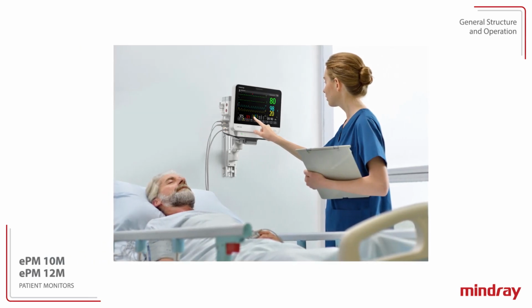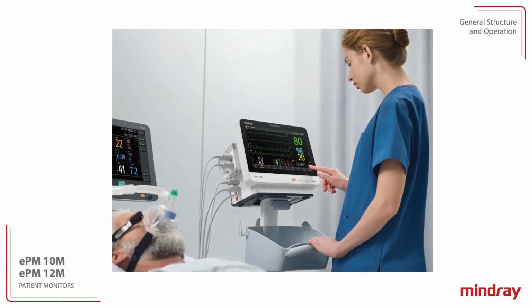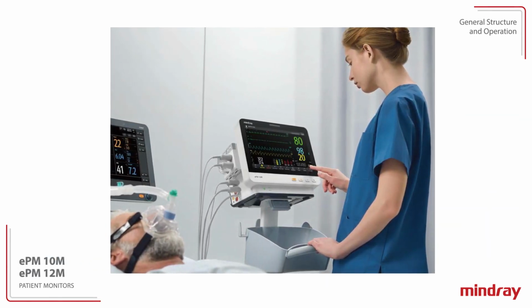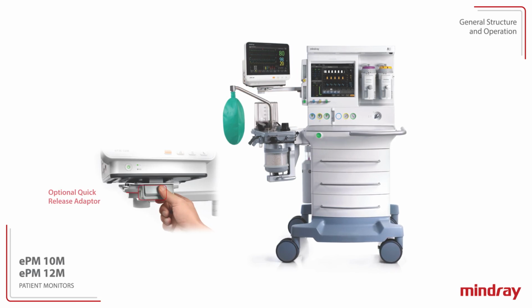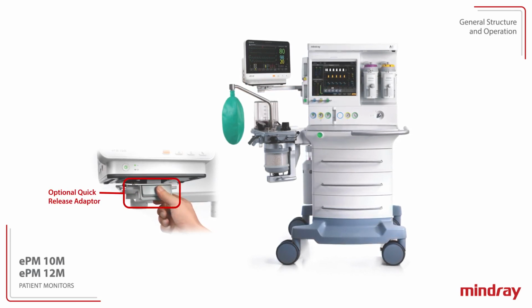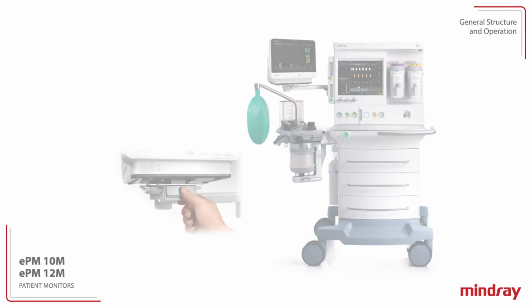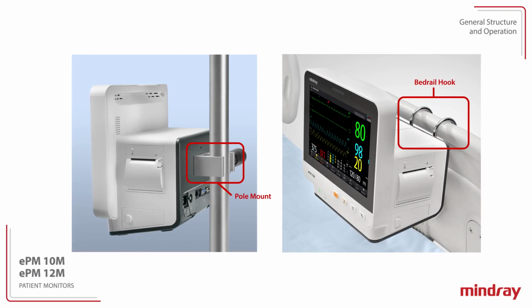The ePM 10M and 12M patient monitors may be mounted on the wall or on a rolling stand. The ePM 12M monitor may also be mounted on the side or on top of an anesthesia machine. An optional quick-release adapter is available for use with the wall mount, rolling stand mount, and arm mount. Other mounting options include pole mount and bed rail hook.